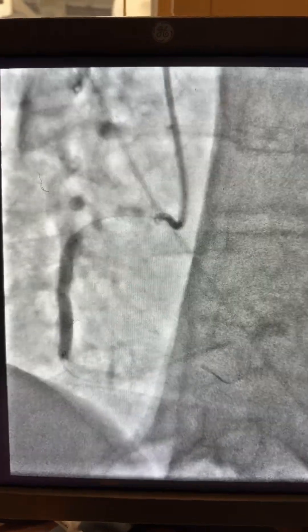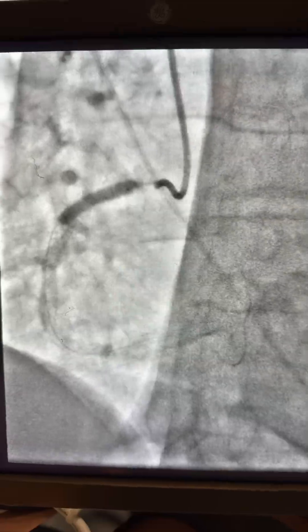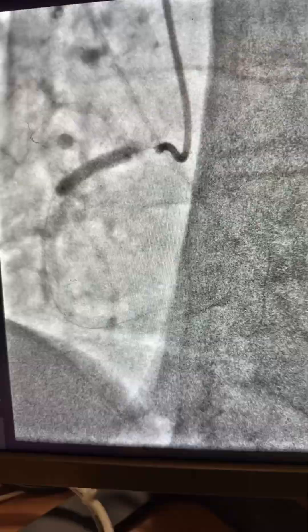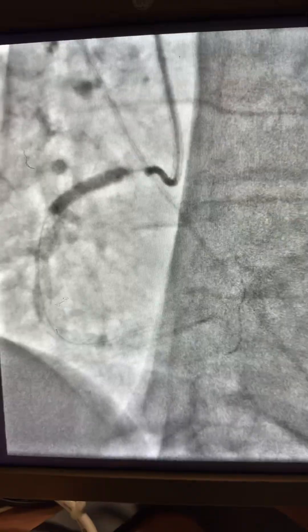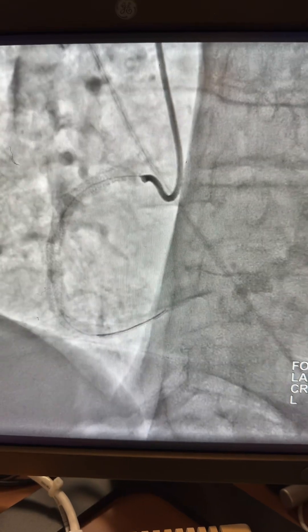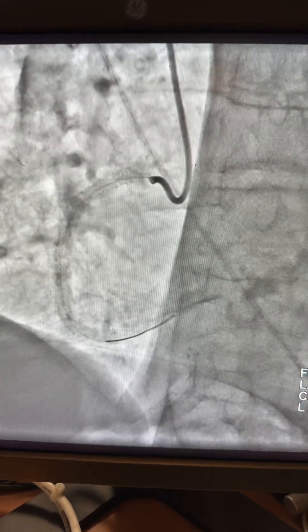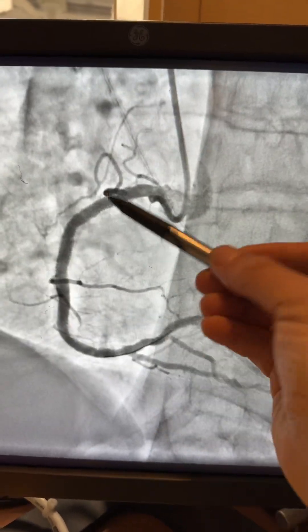After all the shock wave runs, I used 3.8 millimeter stents, which went in smoothly and expanded very well. Here is the proximal stent expanding well — both stents are 3.8 millimeter.